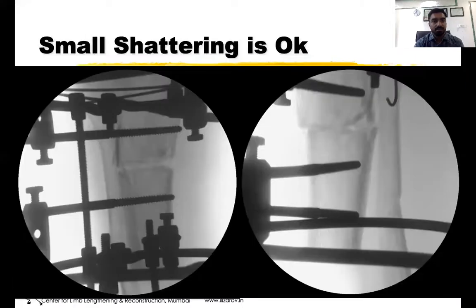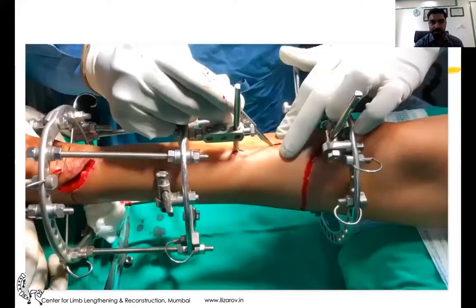You can appreciate here that small shattering is okay, because the posterior cortex of the tibia or femur is strong enough that it may shatter sometimes — but make sure that it shatters with low energy, for which you may need to make multiple holes. Small shattering shows that your corticotomy is of low energy. If there is a large third fragment and more shattering, that indicates the corticotomy was done with a higher force of the mallet or hammer — that should not happen. It should be done as minimally as possible.